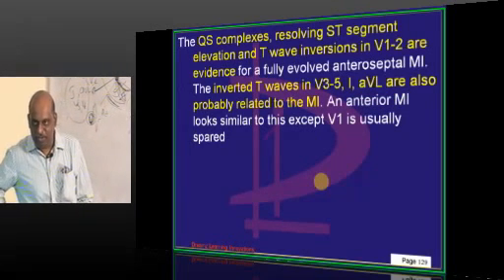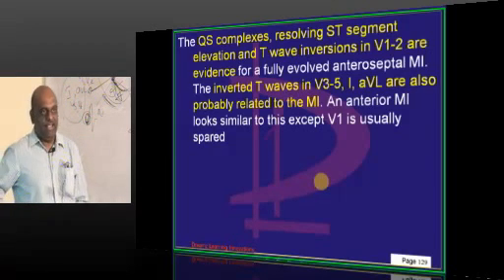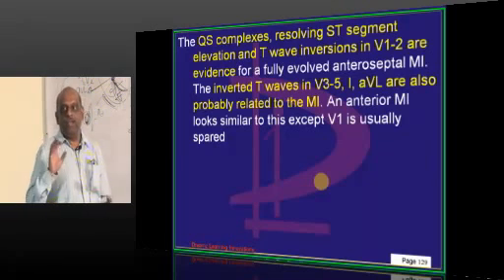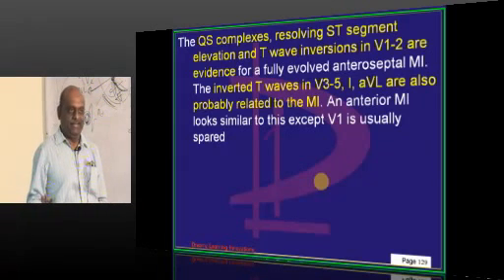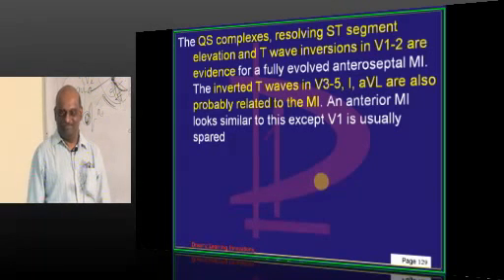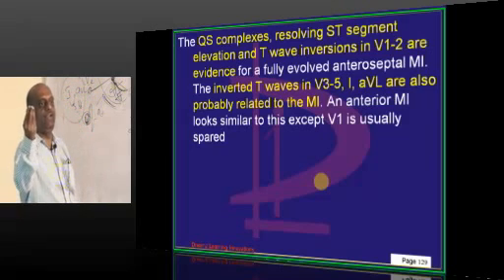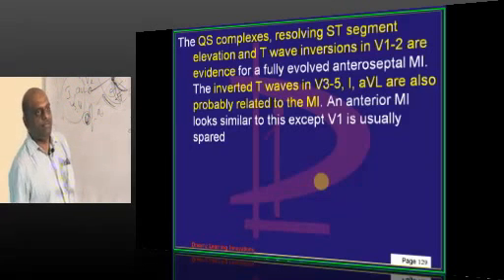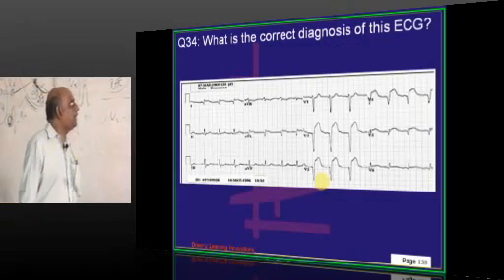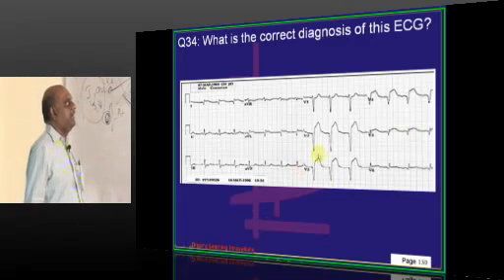Just before we said, Q wave in V5, V6, AVL and lead 1, if deep, is abnormal. But if it is in V1, V2, it is also abnormal. V3, V4 also, prominent Q wave is an indication of abnormal. Hence it is anteroseptal is what you need to remember. So what is the correct diagnosis in this ECG?